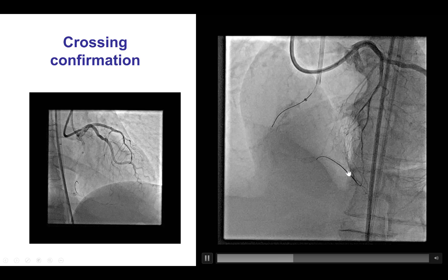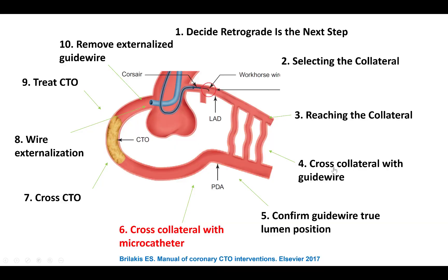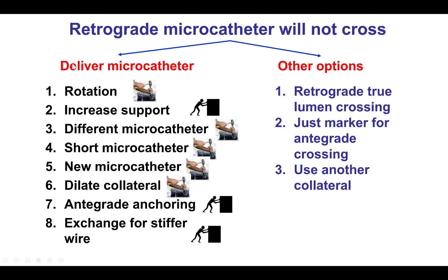We confirmed distal true-lumen position of the guide wire, but then we had the problem that we could not advance a microcatheter through that septal. There are different options to try to deliver the microcatheter. If all fail, another option is using the guide wire already in the retrograde true lumen to try to do true-lumen crossing. Unfortunately, that was not an option here because the SUO-03 is a very soft wire with little penetrating power.